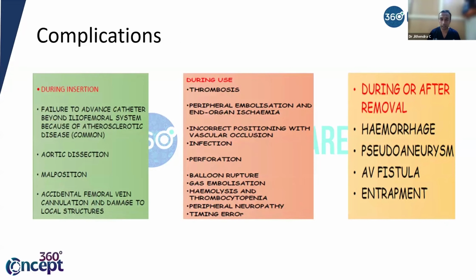Whenever they ask you about complications, as we always tell in our course, it is better to classify, divide and categorize them. You can do this for any procedure for that matter, be it intubation, ICD, or defibrillation. You categorize them into complications during insertion, during its use, and during removal. That will make your job easy, and you'll get answers for each. That will cover most of your answers, and you will not miss anything. If you blindly answer, you may miss certain important points. If you subdivide them, it is easy for you to answer, and you'll get multiple answers.